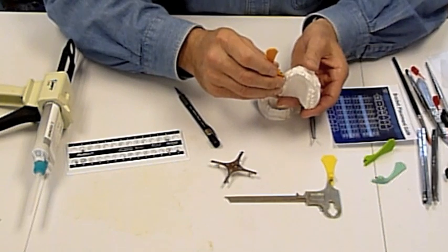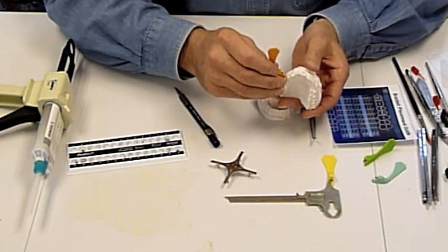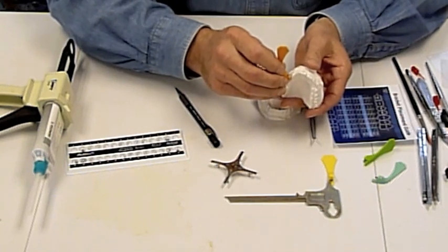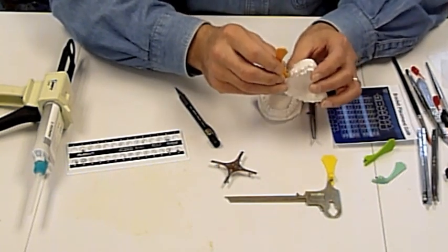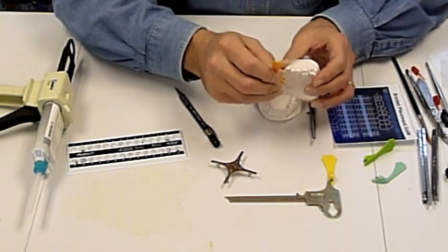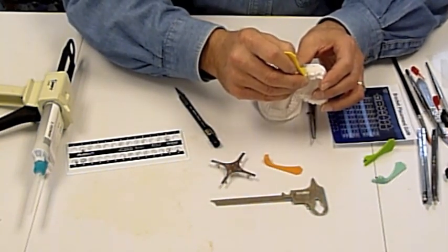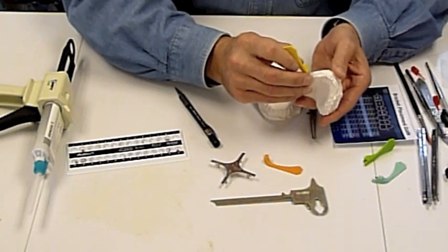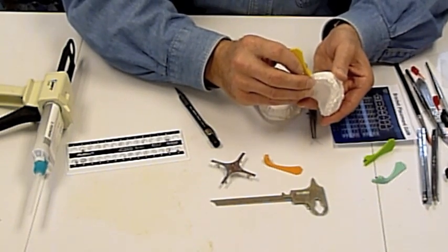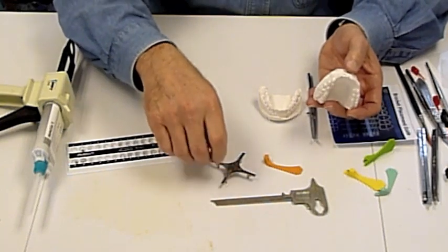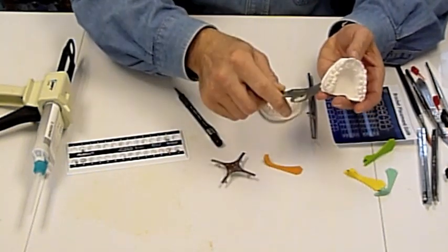You take the gauge for the laterals at four. First bicuspids will be four. The second bicuspids is three and a half, and the molars are at three, which we'll use the boon gauge for.